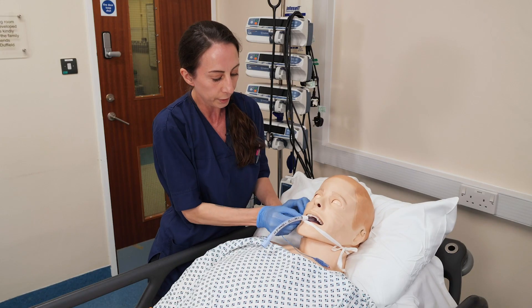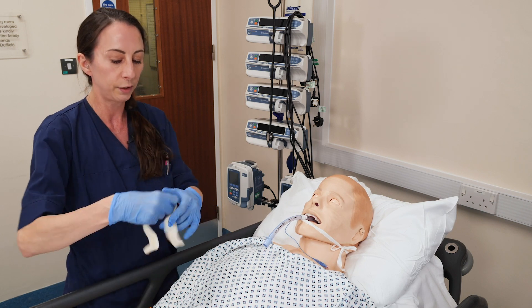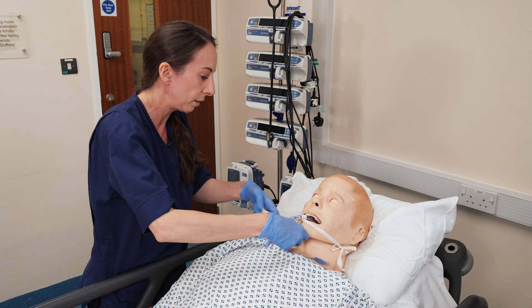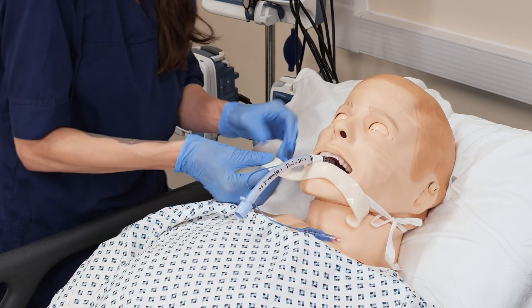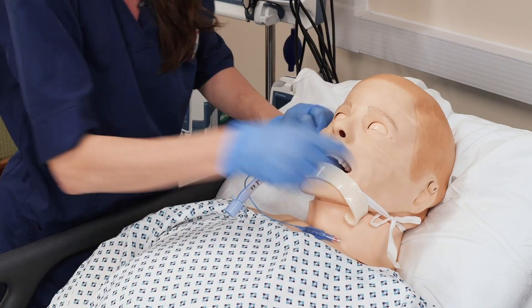Obviously we want to reduce the risk of pressure to the patient when you're using a tie. So we use a silicon strip — a nice long piece, a good 20 centimetres long. Right in the centre, you're going to put it either side and just lift it through on both sides.